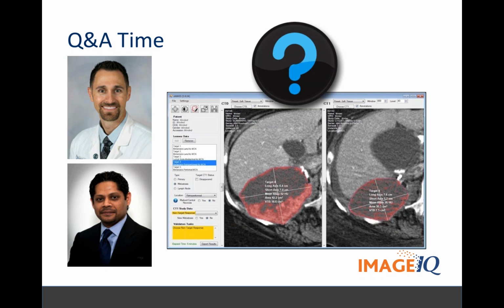Andrew, the question is, can you do volume-like measurements on CNS lesions for primary brain tumors? We haven't adapted that.